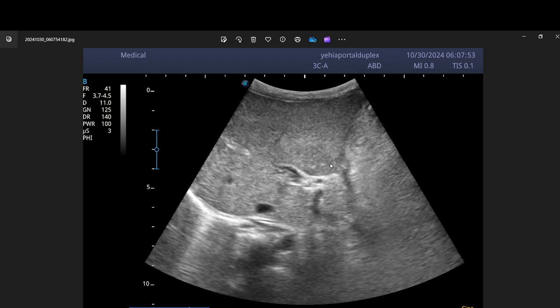Even if after removal of the catheter the patient didn't have symptoms directly, maybe he had a portal vein thrombus that was acute, then developed to be subacute, then chronic, and then cavernous transformation, which usually occurs after about 6 months of the initial thrombosis of the portal vein. This is a possible clinical scenario that had happened to the patient. We definitely have here, by ultrasound and Doppler, portal vein cavernoma.